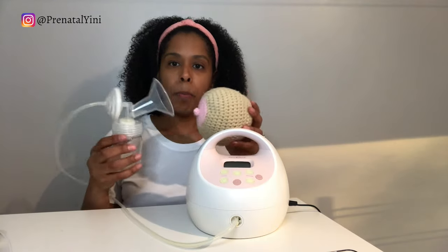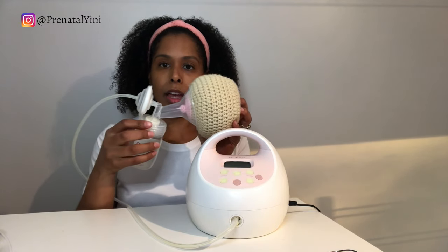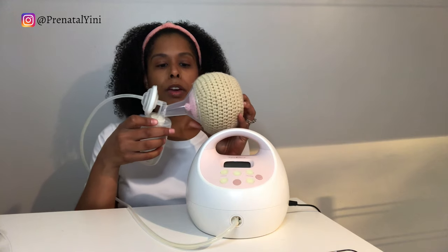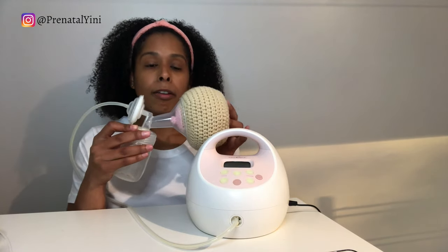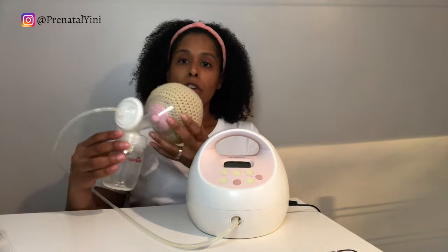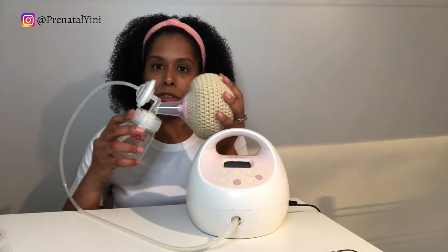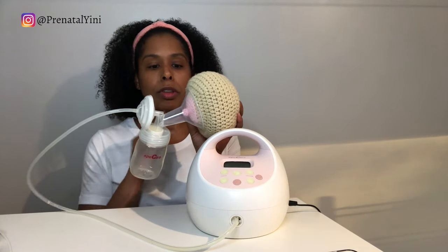When you pump, make sure you center the nipple into the tunnel of the flange. You just want the nipple to move in and out — we don't want a lot of areola inside the tunnel, and we don't want rubbing on the sides. If you need help with flange fitting, you can reach out to an IBCLC in your area or contact me for a consult.